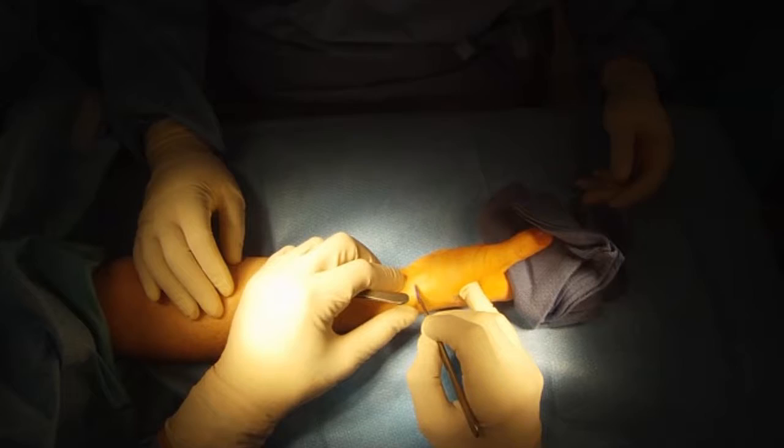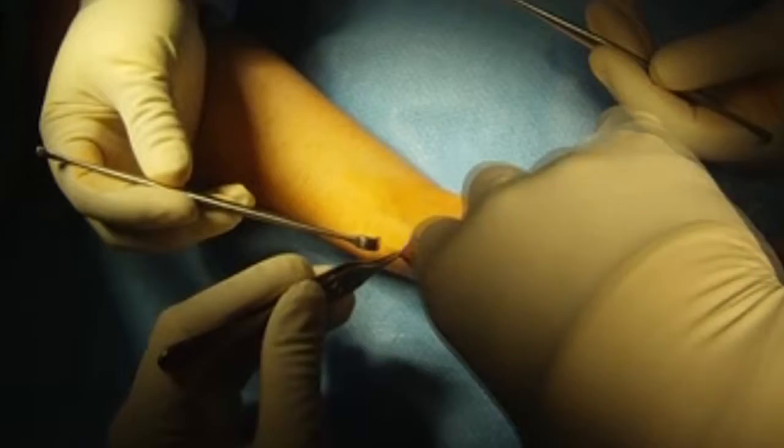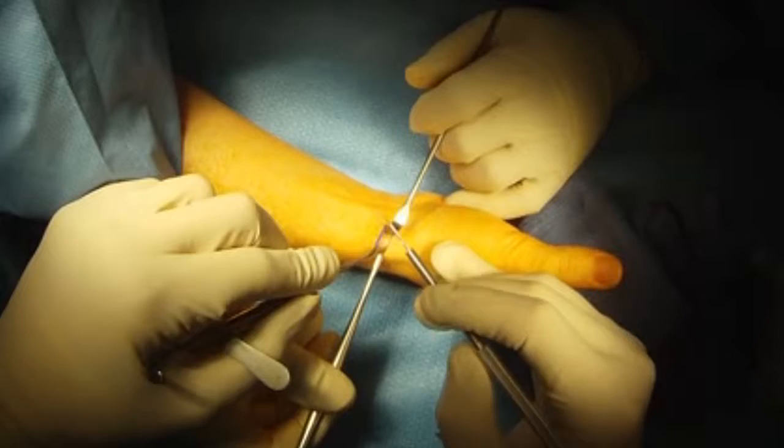De Quervain's Release. I make a small cosmetic incision on the wrist over the inflamed tendons. I dissect down with scissors to avoid cutting the nerves that lie over the sheath. I dissect the nerves off of the sheath.